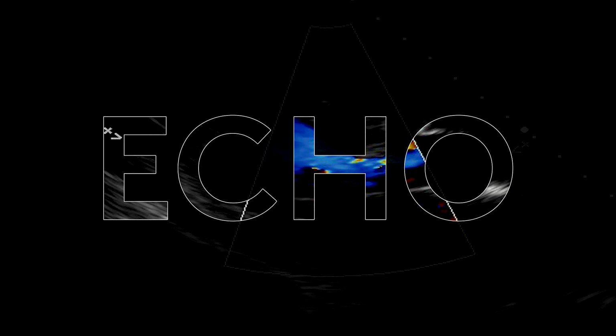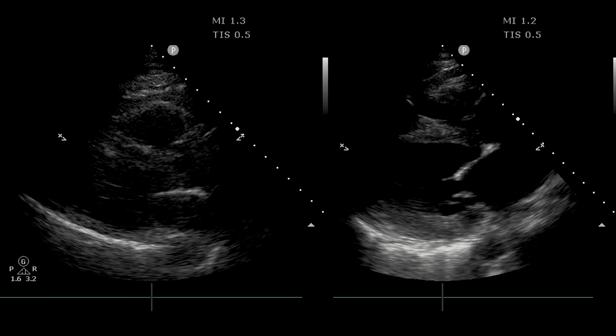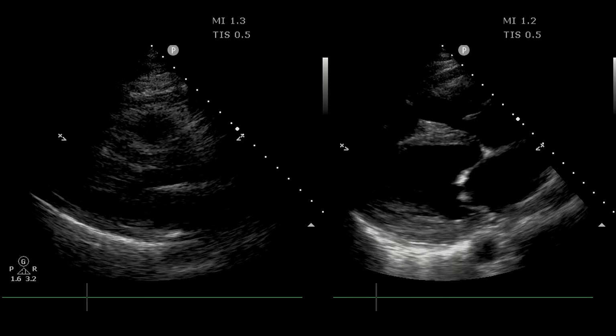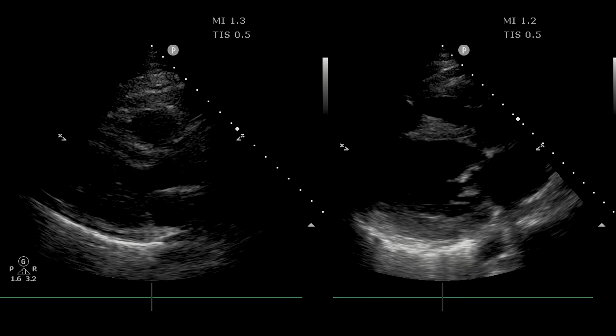So again, we're looking at effusion, chamber size, valvular problems, blood flow through it. What's the ejection fraction? Just as a reminder, anything that's less than about 50% for an ejection fraction, we're going to be considering abnormal for these conversations. Generally normal is somewhere in that 55 to 60% range and above. There are multiple ways of getting after this, and we're going to look with our ultrasound. On the left is a decently normal ejection fraction. Here on the right, a low ejection fraction. And how do we make that determination other than just looking at hundreds and hundreds of different echoes?